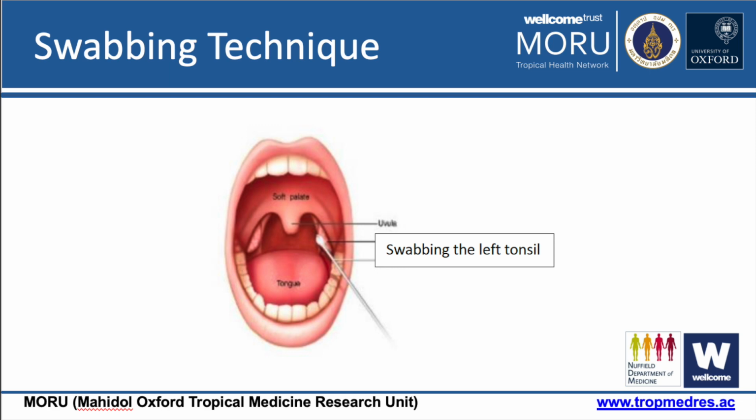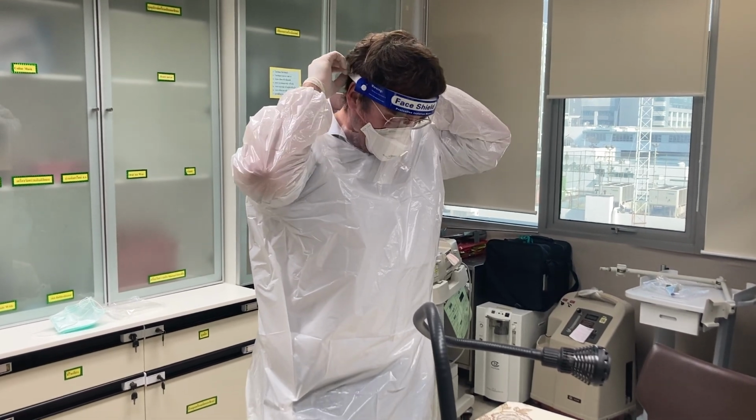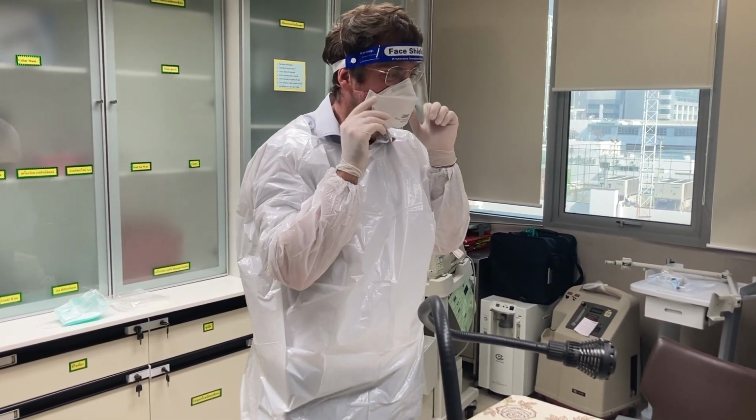Swabs must be taken exactly according to this standard operating procedure, even if those guidelines differ from the procedures in your hospital. Personnel taking oropharyngeal swabs for the study must have completed training and received a sign-off for swab proficiency by the site PI. Full personal protective equipment should be used by the person taking the swab.